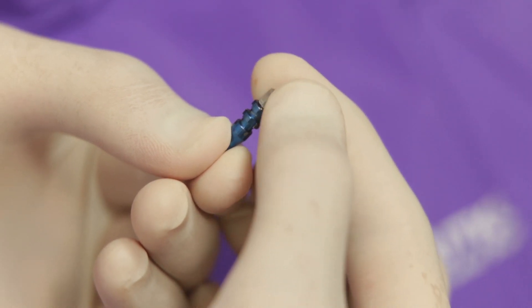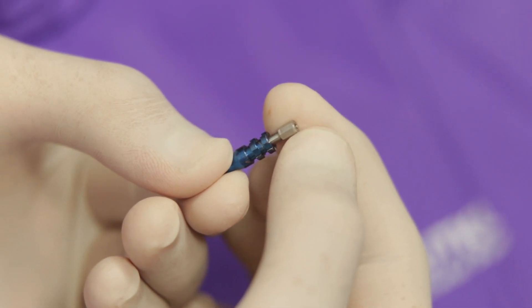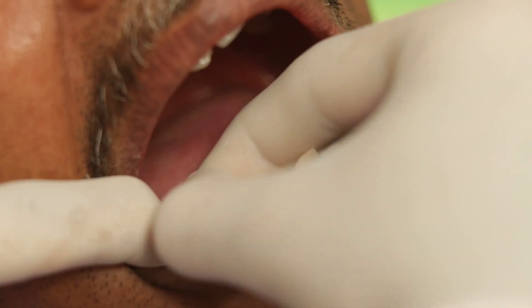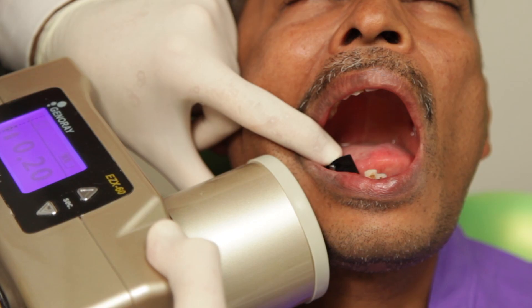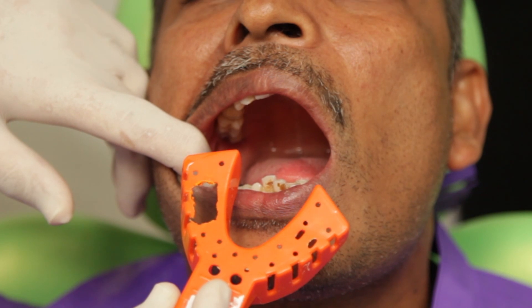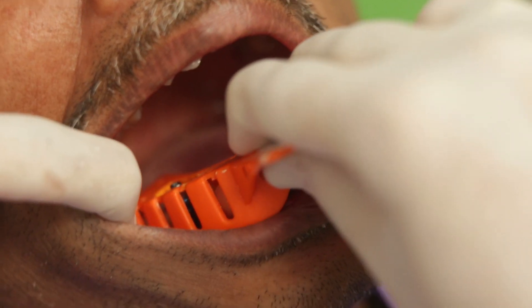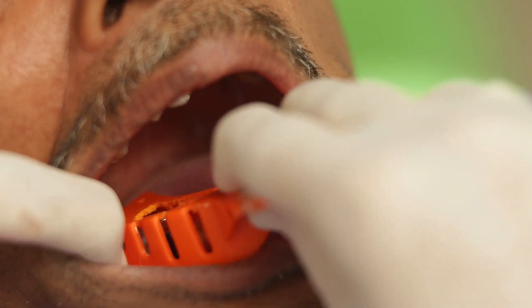These slots will enable the post to be embedded into the impression material. This screw will project outside the tray, and once the impression is set, the screw will be opened up and the impression post can be picked up with the impression. I am now going to seat the impression post onto the implant and tighten the screw. I will take an IOPA to verify complete seating. After verifying that, I will try in my impression tray. You can see that I have made an opening on the impression tray with some micromotor burrs so that the screw can project out.